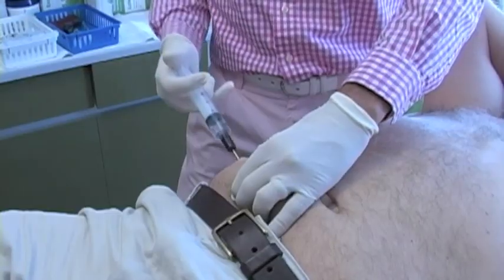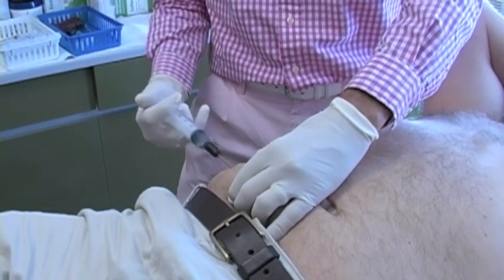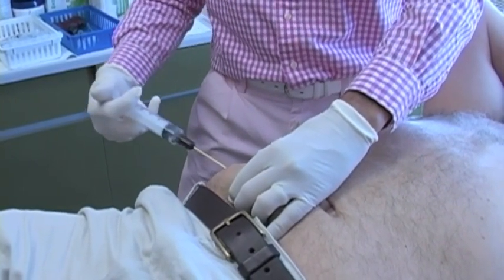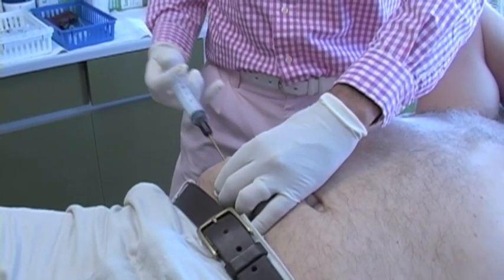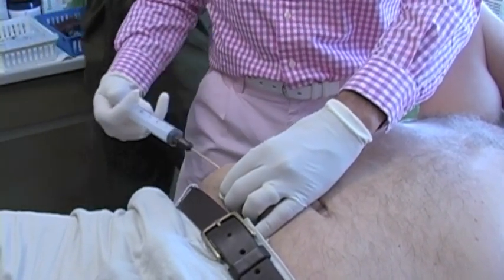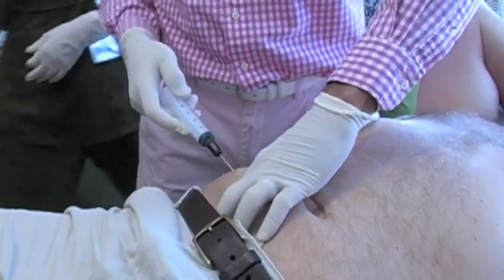Stem cells or progenitor cells can come from the fat. Here I am anesthetizing somebody's subcutaneous fat around their hip joint or pelvis. What you're trying to do with lipoaspiration is to break up the fat and make it into a liquid form, so the adipose cells can then be aspirated.